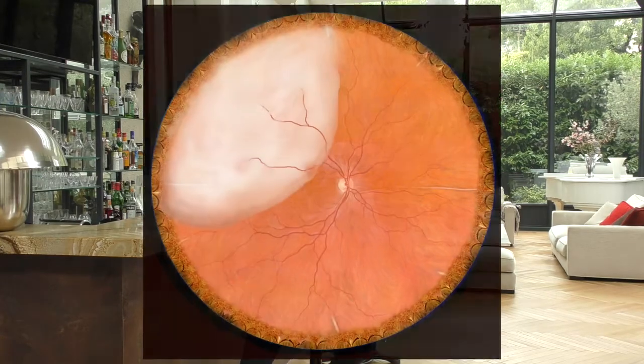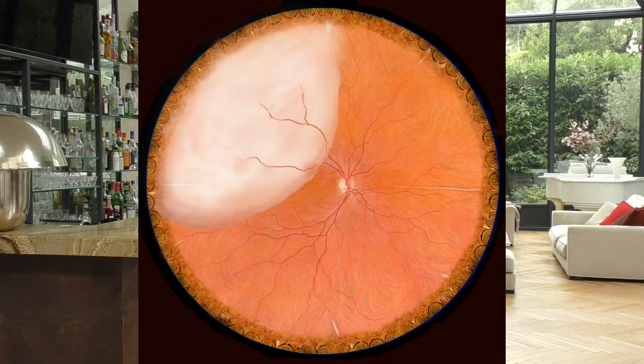If, on the contrary, the connecting lines are at right angle to the pars plana, or even if they go back, this means that the liquid which passes through the tear pushes the retina in all directions. The responsible tear is therefore in the central part and cannot be adjacent to the connection area. Well, you have noted all the clinical details and your drawing is consistent with everything we have seen.